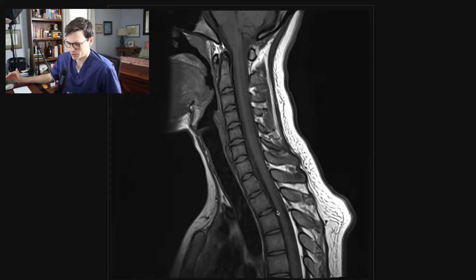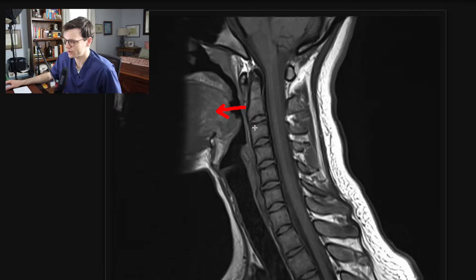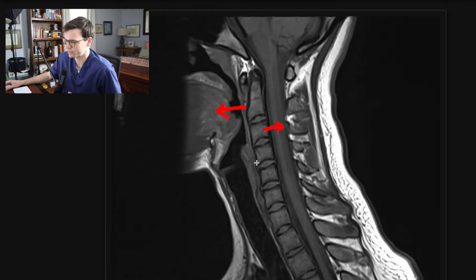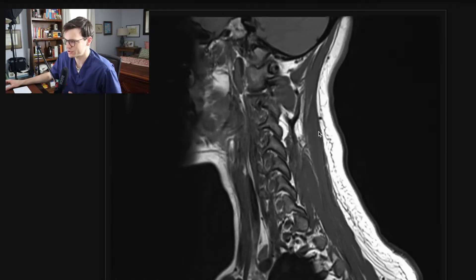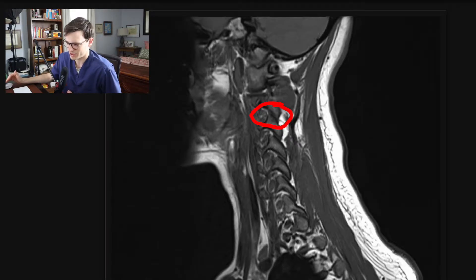Listhesis comes in two forms: anterolysthesis or retrolysthesis. Anterolysthesis is when there is forward subluxation of the top vertebra with respect to the one below it — so anterolysthesis of C2 on C3 would be C2 displaced anteriorly with respect to C3. Retrolysthesis of C3 on C4, on the contrary, would be posterior subluxation of C3 with respect to C4. You can then look at the different facet joints at every level, making sure those look normal. You can have jumped or perched facets, particularly in trauma, indicating ligamentous injury and malalignment.